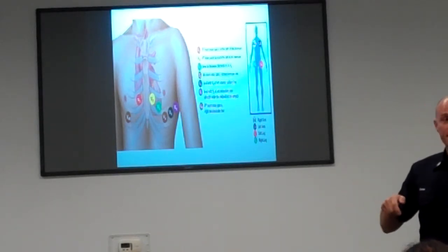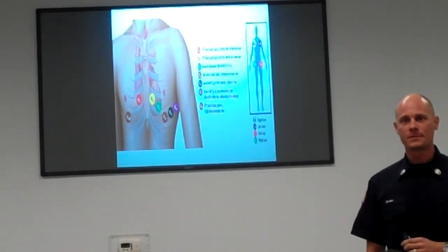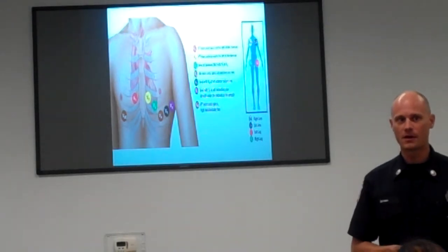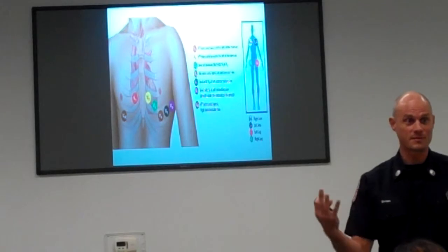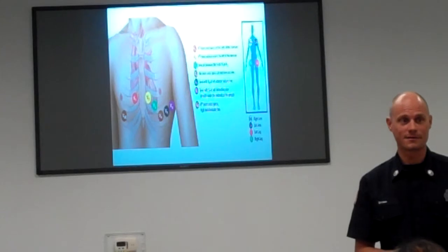Okay? Charlie, what do you think about placing it on the bone or on the muscle? Through the muscle or the intercostal spaces, or is that what you're getting at? Yeah, I think that's probably a little bit more appropriate. Okay. I've heard of bone placement if you're getting a lot of tremors, like artifact from the tissue, if the patient is tremoring. Hmm. That's just what I heard. I haven't heard that, and feel free to bring that stuff up to me because I want to learn this stuff too. But if it works, good.